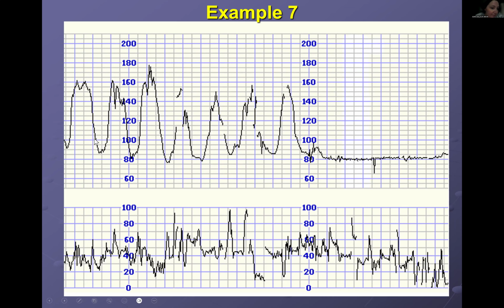And if you were to assume, for example, that this was a contraction, then this is late, and they are persistent, they're persistent and deep. So these are late decelerations, or at most they are variable, because you can't tell with the contractions, but they're definitely deep. So, in my opinion, the doctor should have been called in before, rather than waiting for this bradycardia.